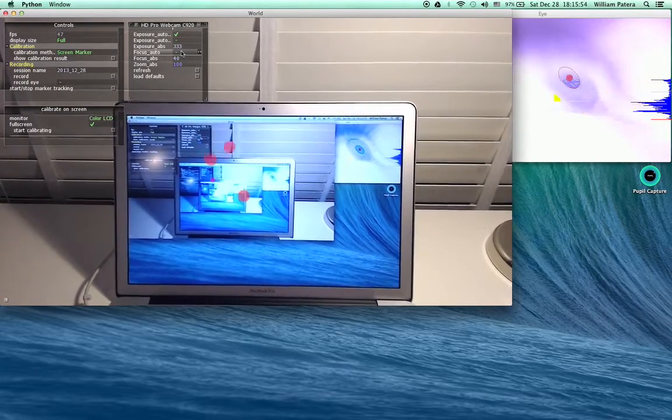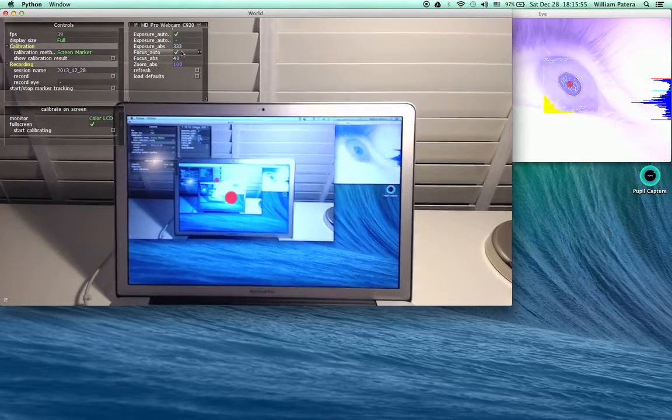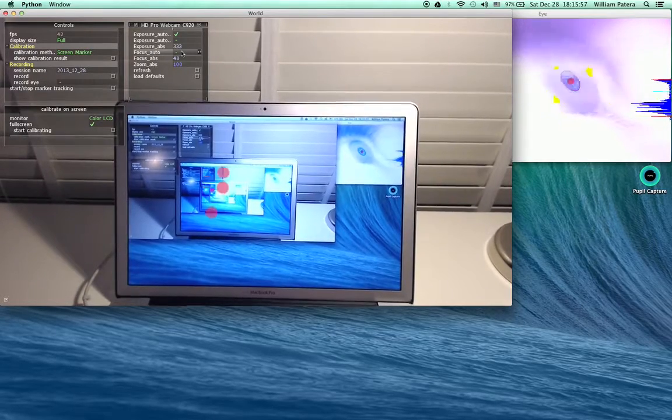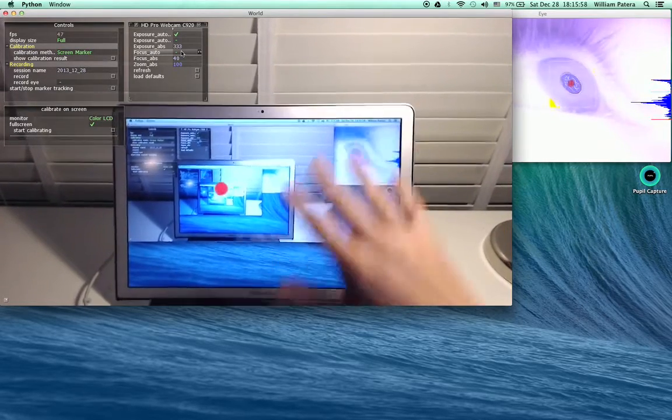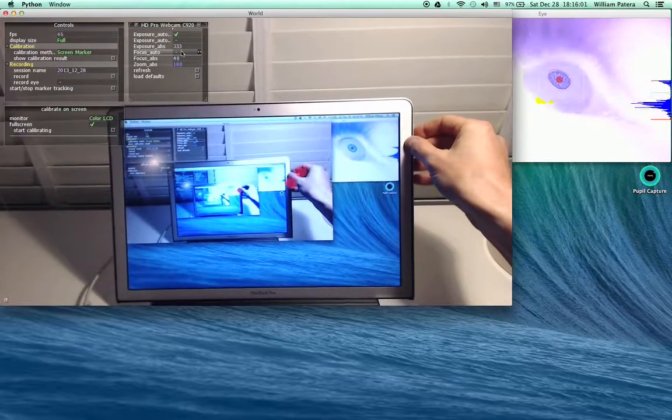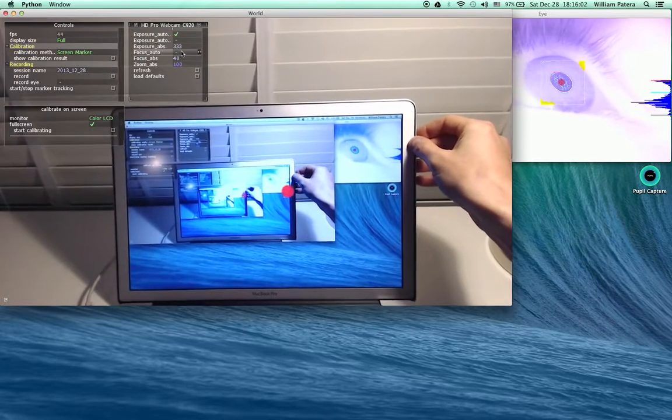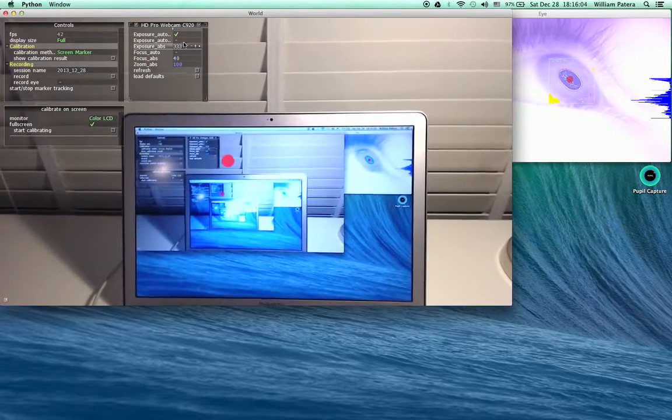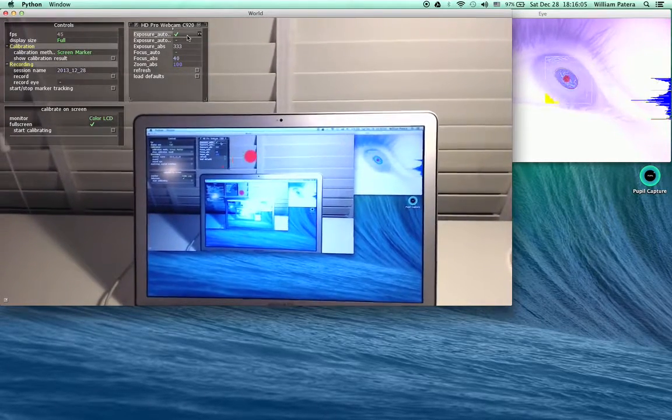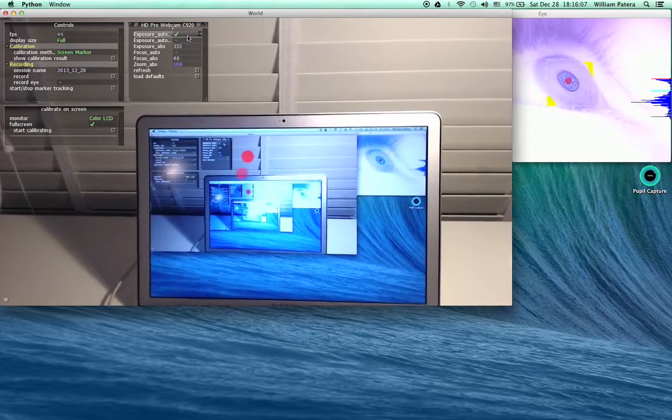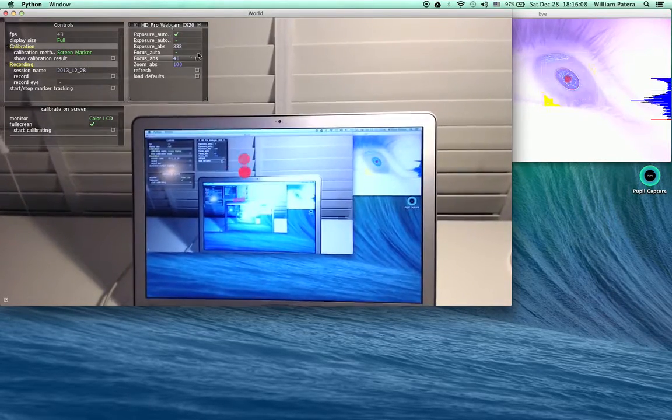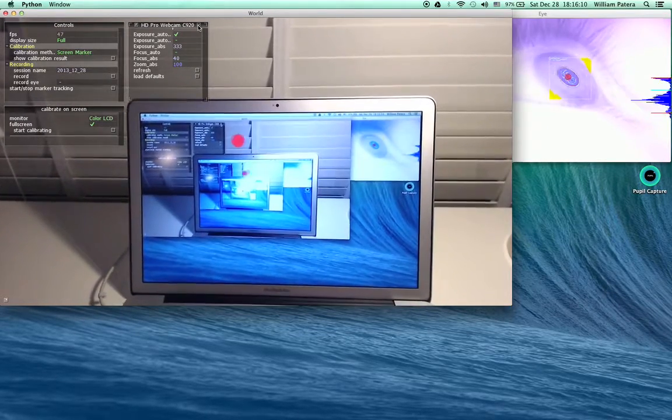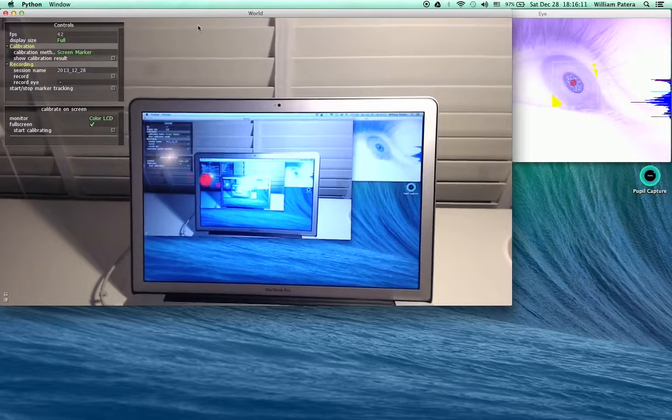Usually I click autofocus until I get focused. I'm going to be using the screen to calibrate, so I want to make sure the screen is in focus. You can change exposure settings here or load defaults. I'm going to minimize this because I'm okay with the settings.